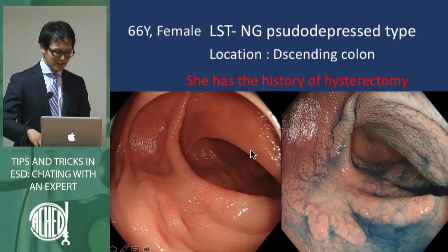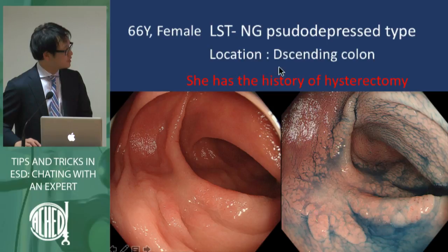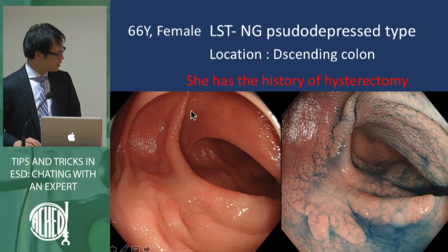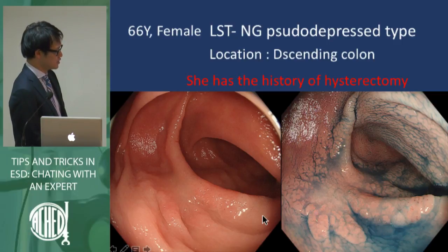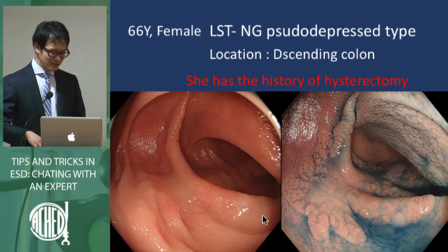So this is also a difficult case. This is a colon case, located at the descending colon. LST, non-granular type, pseudo-depressed type. Initially, it is very hard to detect these regions. So we use spraying of indigo carmine, so it's easier to detect. If the preparation is bad, this region is overlooked. So it is very important that we don't overlook these regions. We should detect these regions.